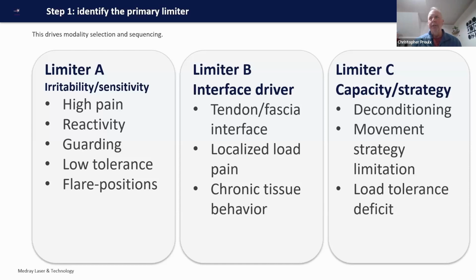And that's where utilizing some of those therapies that are otherwise a little bit more comfortable to deliver, and creating that rapport and that trust with the patient. And that's why the limiter A should be kind of your go-to with laser. So laser's not going to irritate from a mechanical standpoint. You're not moving the patient around. It's usually, in fact, very, very comfortable, especially high intensity laser therapy, because it can create a warming effect, which again, we're not going to get into the physiology, but if it was acute, would I want to use something warm? It's not increasing tissue temperature, like you are with therapeutic ultrasound and shortwave diathermy. So that makes people feel really good.